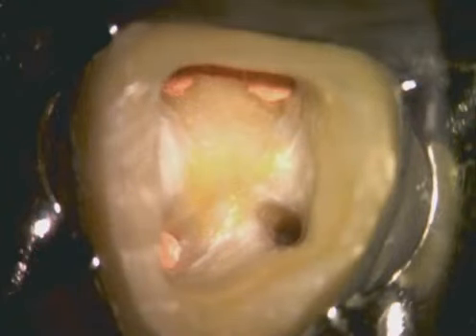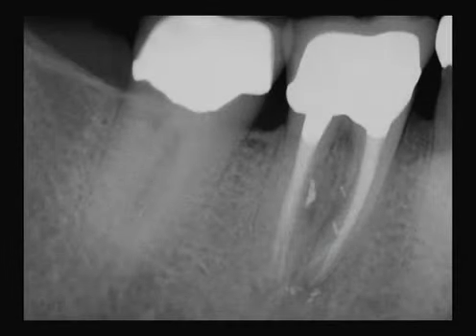Notice the coloration of the pulpal floor and how it takes us to the extra canal. The post-treatment radiograph demonstrates the three-dimensional pack. Here's a recall film at 7 years. Notice the inevitability of the bone to fill after complete endodontics.